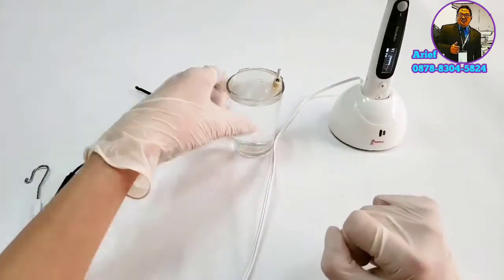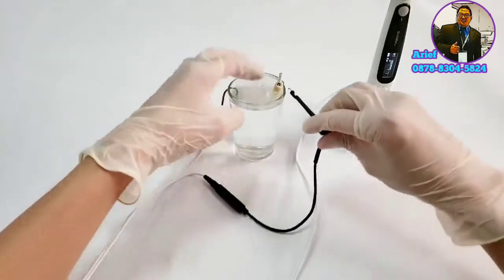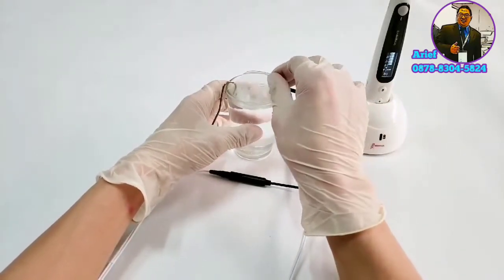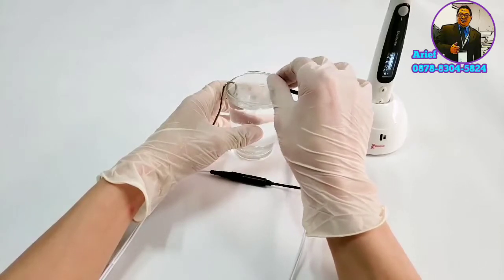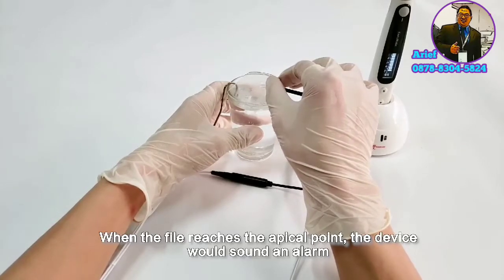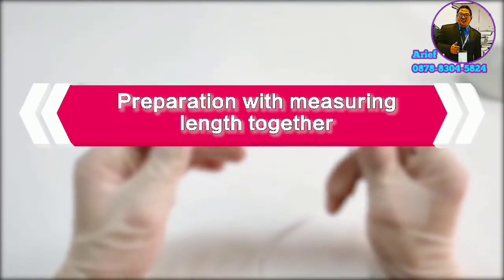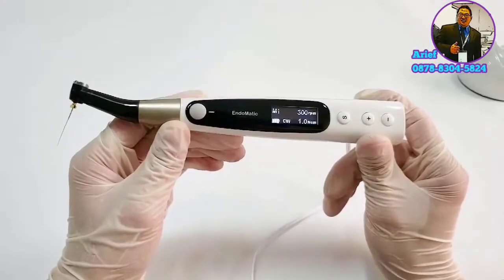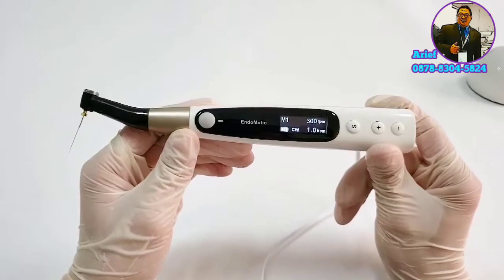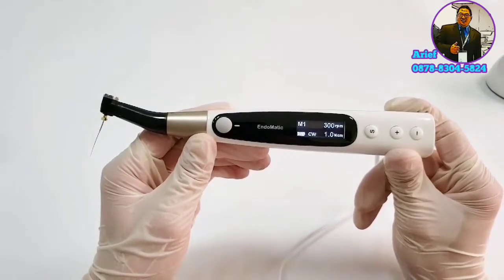Here is a simulator for a demonstration. Hold the file with the file clip, then slowly move into the root canal. When the file reaches the apical foramen, the device will beep continuously. Preparation with the measurement function together is also available — the position of the file tip inside the canal is shown in the display automatically during preparation, making endodontic treatment safer and more efficient.